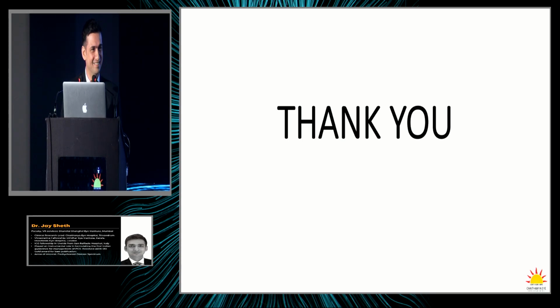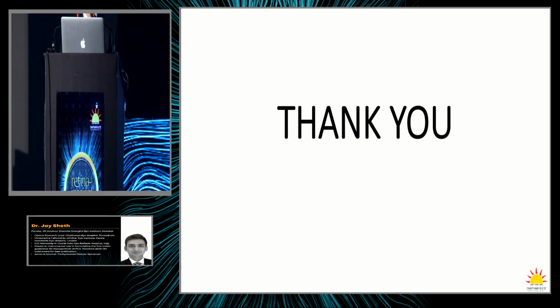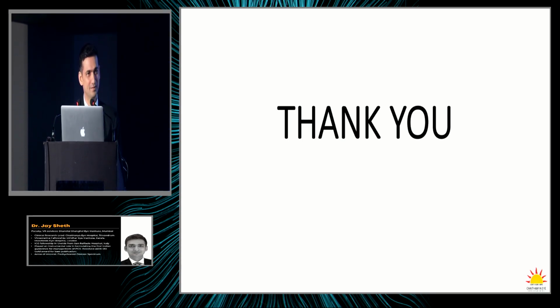So any comment? Yes, please. Thank you for this nice presentation. I would just state that it is really important to know the visual acuity and the fixation of the patient before performing the exam, and also where the lesion is located. Because if you have an extrafoveal lesion, for example, and you would like to do a small, high definition scan, then you need to center that lesion. Otherwise, you can miss it. So I think that's something important for the operator to know beforehand.